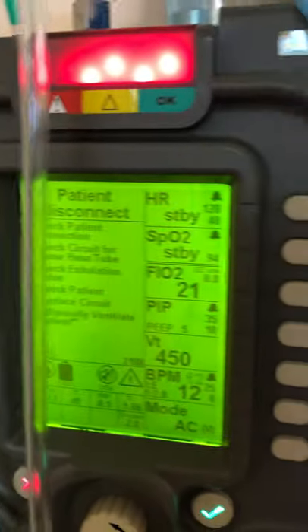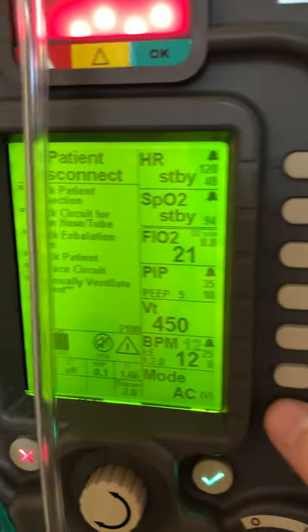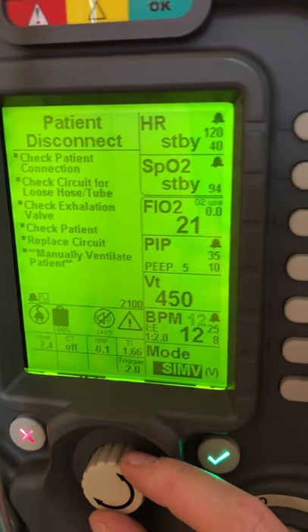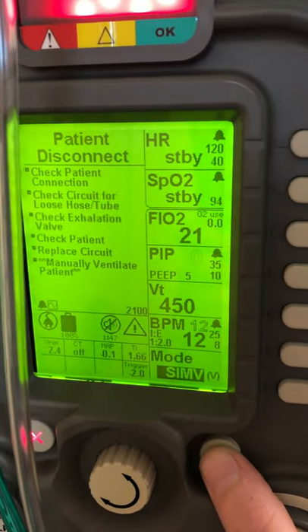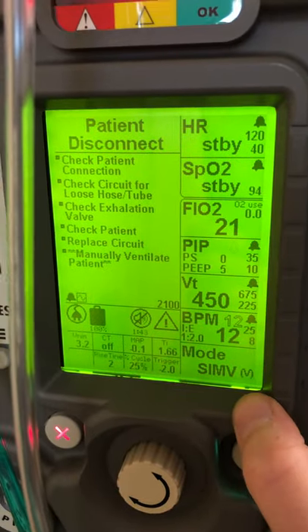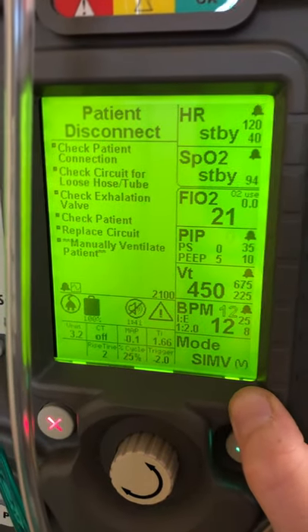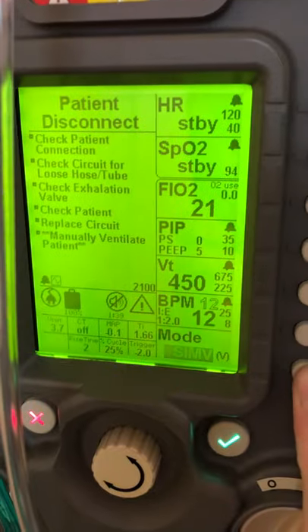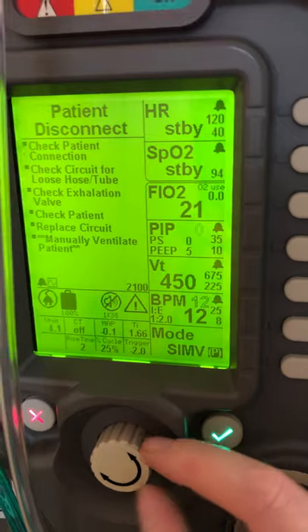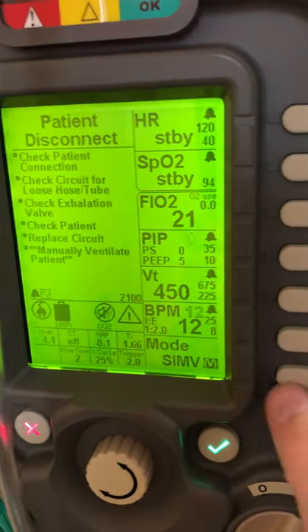Before we put on our patient, let's set up our mode. We come down here and the mode is assist control. We can turn it — maybe we want SIMV. Always hit the check mark to save what you just did. Notice there's a little V here — that's for volume control. If you wanted pressure control, you would hit this twice and it would come to P. Then you can turn this knob to make it pressure. But for this patient, let's leave it on volume.